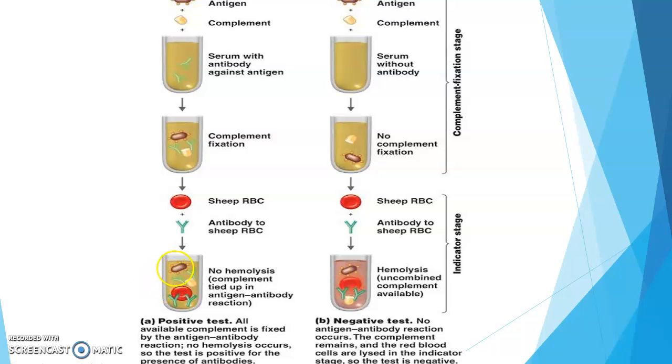All available complement is fixed by the antigen-antibody reaction. No hemolysis occurs, so the test is positive for the presence of antibodies. Next, we see that antigen is added with complement without antibody in the serum.